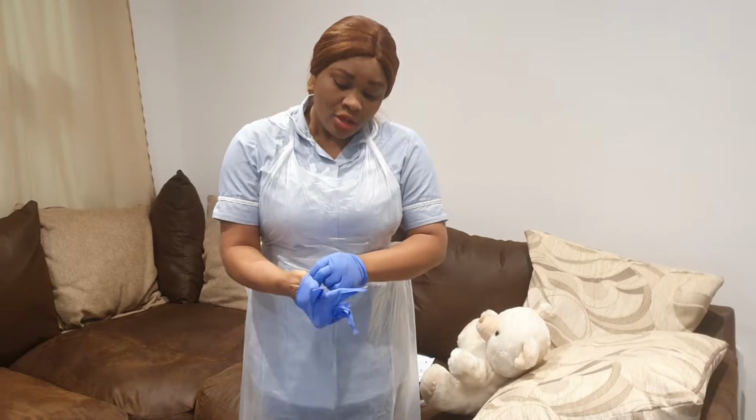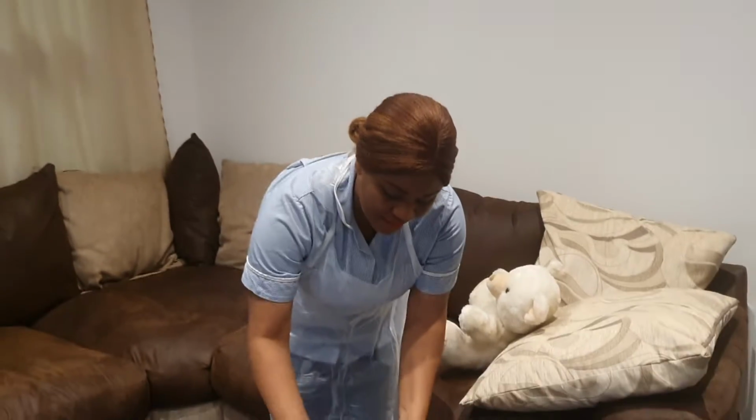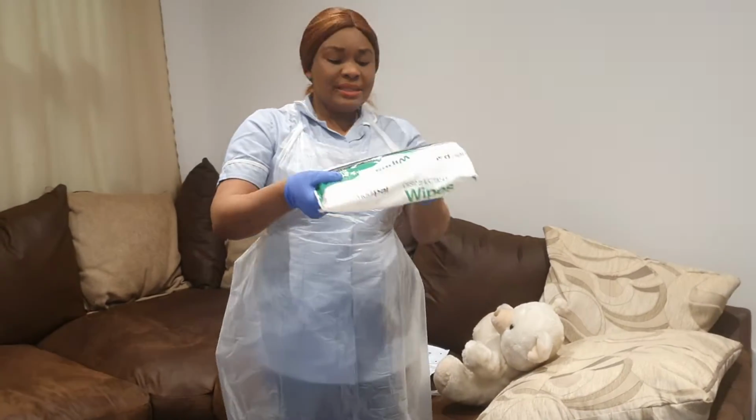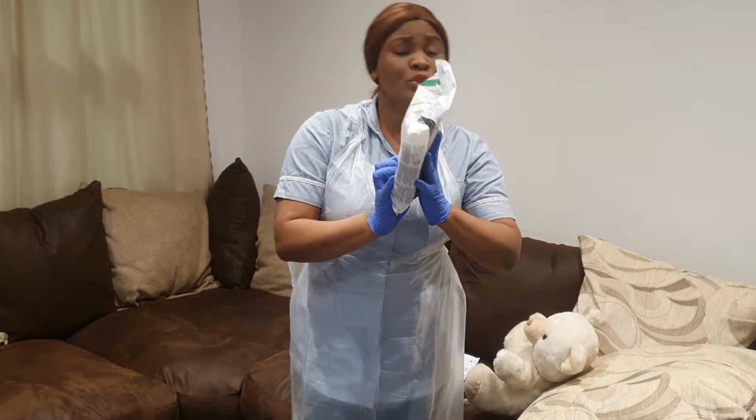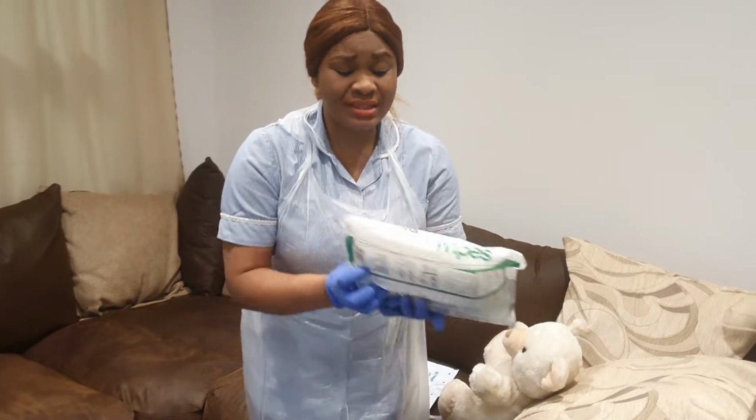All right, guys. So I've put on my apron and my glove. I'm just going to be validating my cleaner wipe. So this is my cleaner wipe. The expiry date is 2024, so it's still valid. I'm happy to use this. You can find this here.